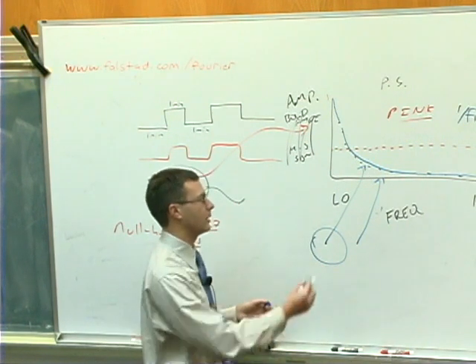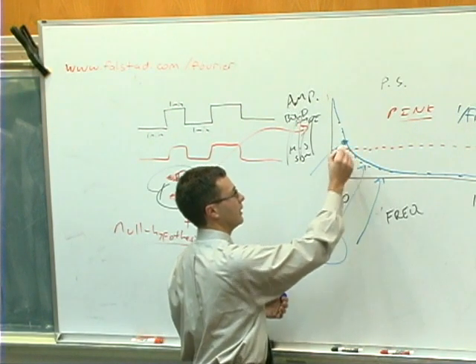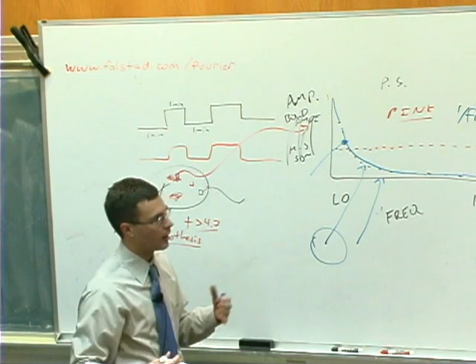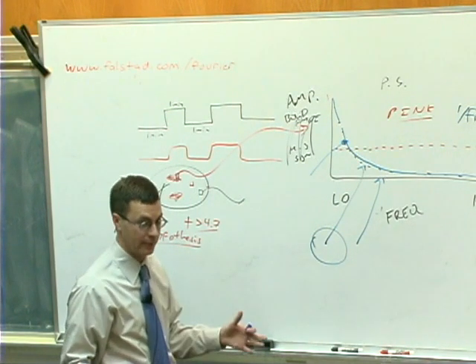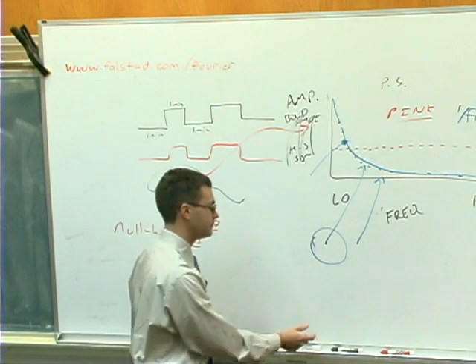You'll also hear the explanation every once in a while that this is just physiologic noise, cardiac rhythms like the heart beating and people breathing. Maybe a little bit of it is, but most of it is just fundamental properties of the scanner. It's unavoidable and irreducible.